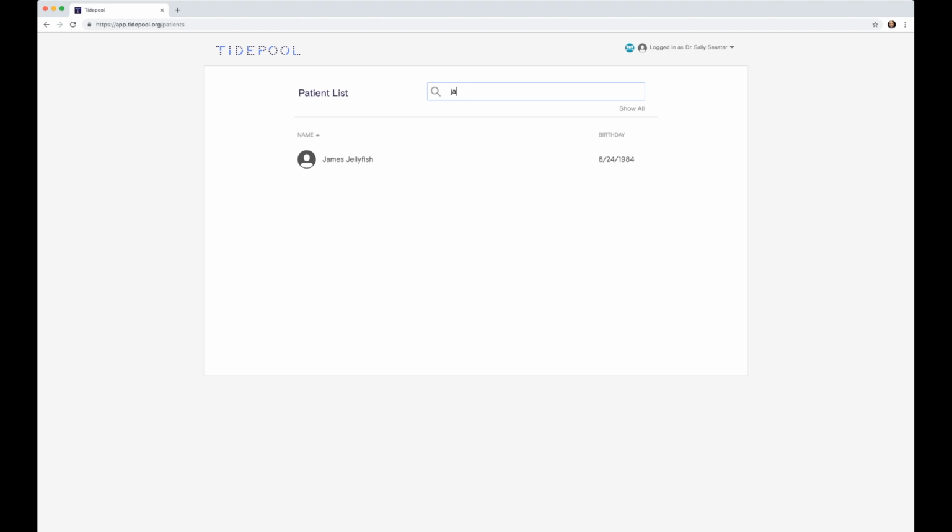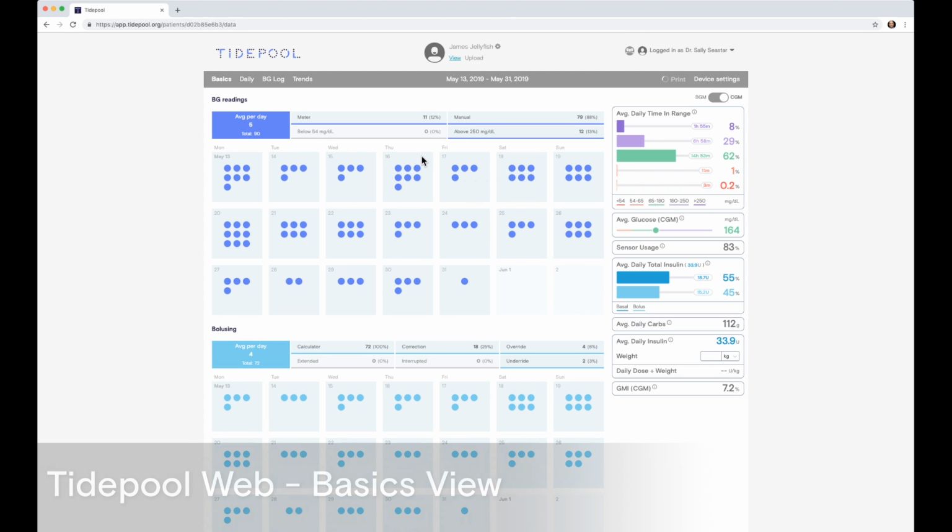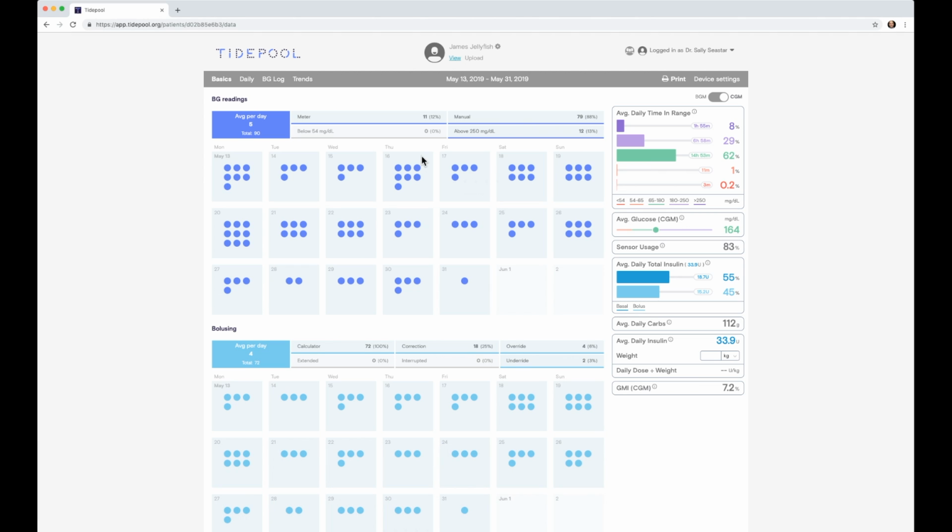When you're ready to start reviewing your patient's data in Tidepool, simply enter the name into the search bar and click on their name to begin. To start, we have the Basics view, which is a 3-week device summary for every device that's been uploaded to your given patient's account. You can see at the top the most recent 3 weeks of data that we have available within the Basics view, in this case for James Jellyfish, May 13th through the 31st.